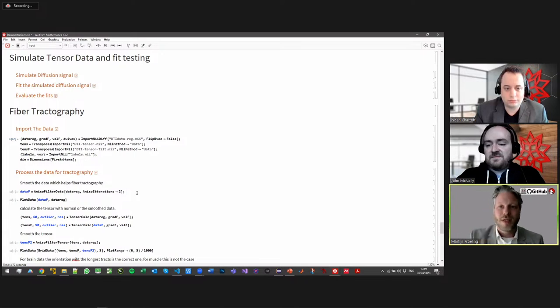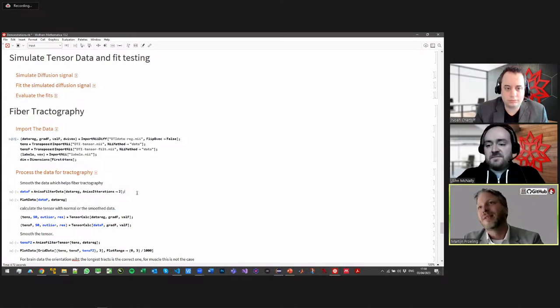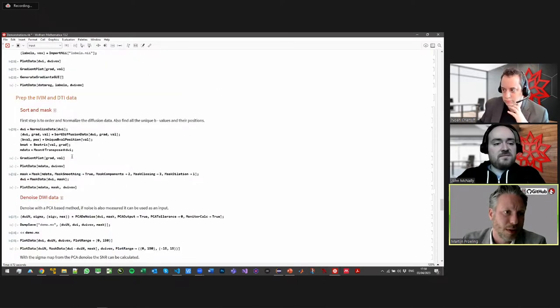Data analysis, and preparing the data for analysis, is sort of an endpoint, where I have my Excel sheet or my export from Mathematica to whatever format I want. Then I start doing the last part, statistical analysis, and plotting and stuff like that. So it's typically more convenient to split it up. There are some tools that I've pre-compiled as executables, and from the Mathematica language I run commands on the command line to call those tools. For example, to do image registration, which I think is also an example here.